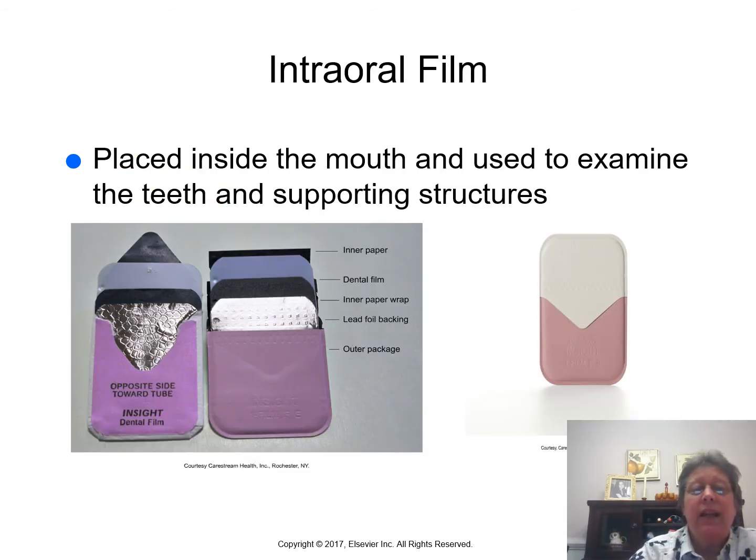This is just an example of our intraoral film, and we've said many times before that it's placed inside the mouth and it's used to examine teeth and the supporting structures, which would be the bone level around the teeth.